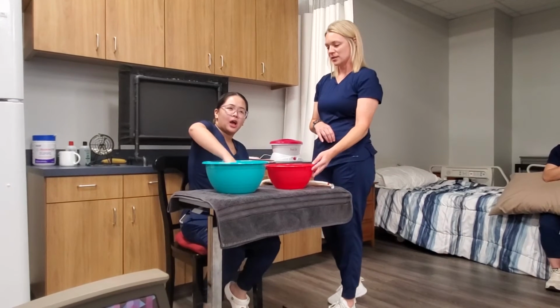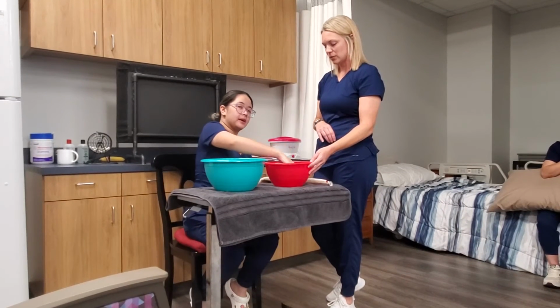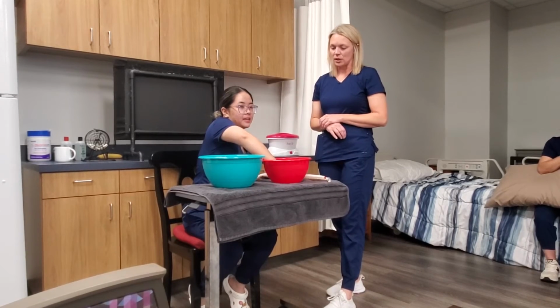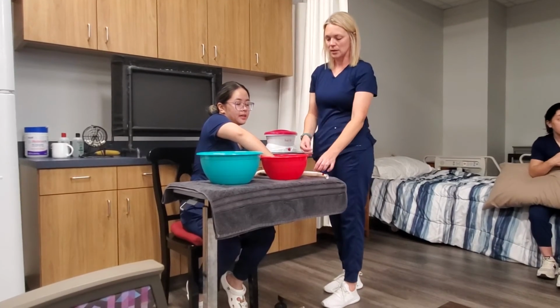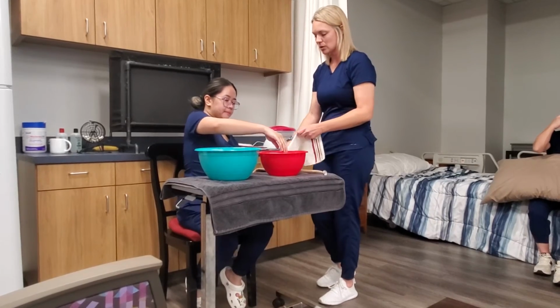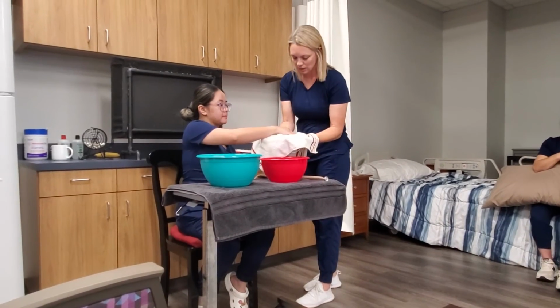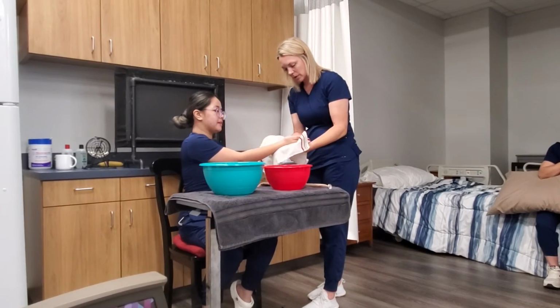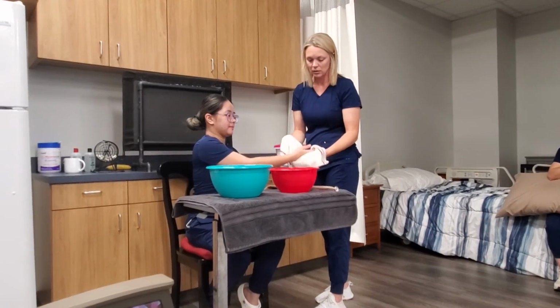Okay, and you're at 4 minutes, and so we're gonna come back. So fortunately you get to end in a nice one. Real gentle, you're doing a great job. Okay, and it's been your 4 minutes, so if I can look at your hand. Okay, all right, so how's the pain feeling? Oh, it's way better. Good, good, okay.